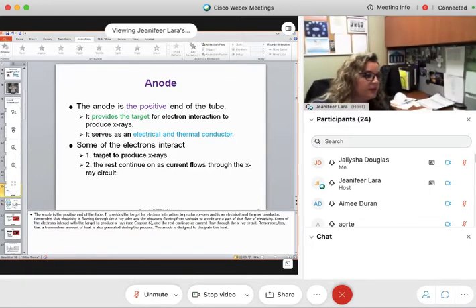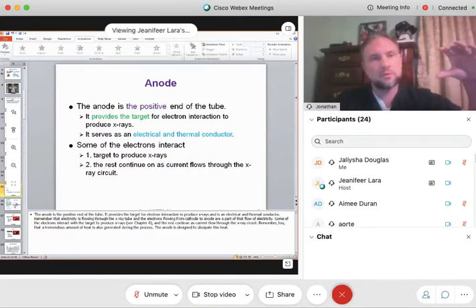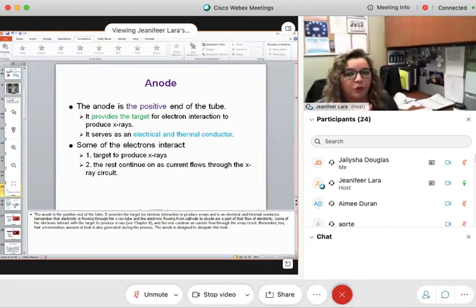Go ahead, somebody else. What is electromagnetic induction? It's like when the electromagnetic fields that are generated by the stators are able to mutually induce the rotor to turn. And so where, you call it stator, I call it stator, but where is the stator located?